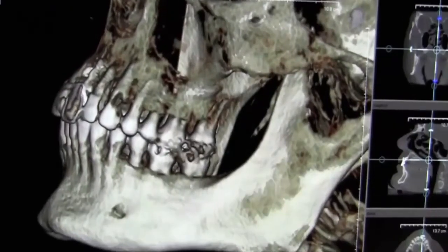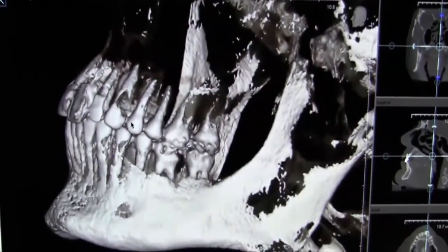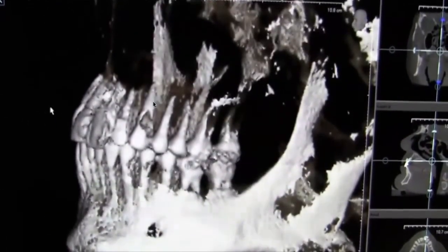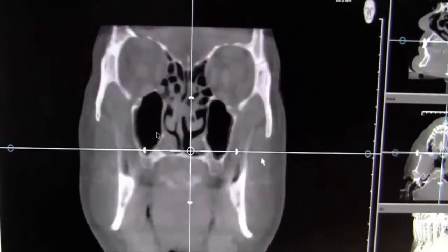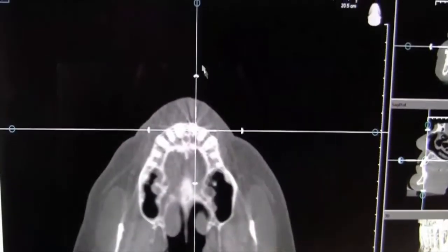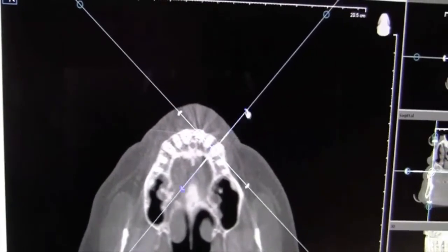maximizing placement. During the cone beam CT imaging evaluation, we were actually able to isolate the roots and look at the distance between each root within the adjacent teeth, look at the extension of the lesion, and at the end the patient decided not to have orthodontic treatment done. He preferred to have the tooth extracted and implants being placed.